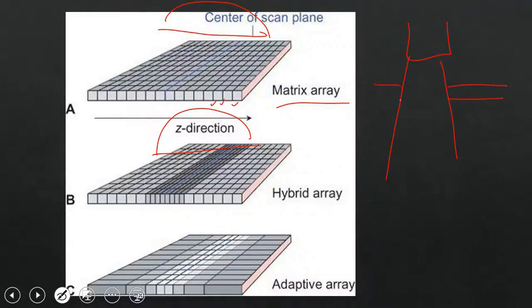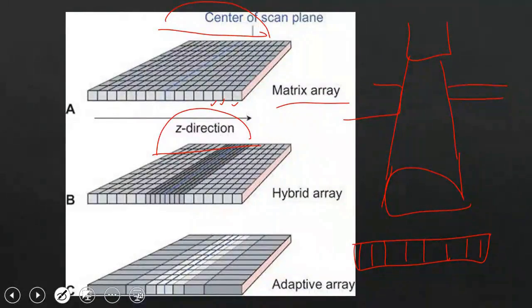Here we have collimation, and here, as you can clearly see, I have a patient and a detector. Now, to put it simply, I clearly have essentially 16 rows of detectors. If I want to use less than 16, what should I do?